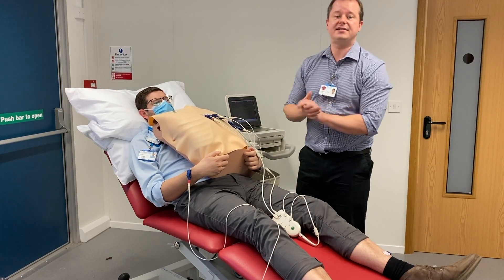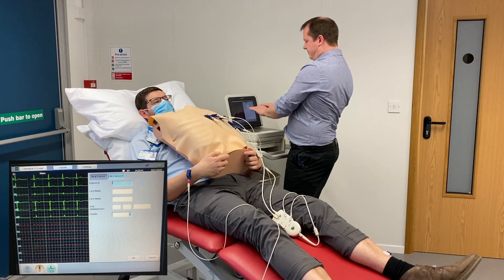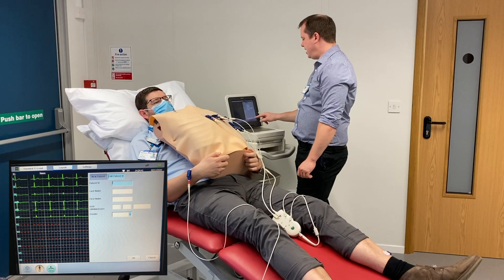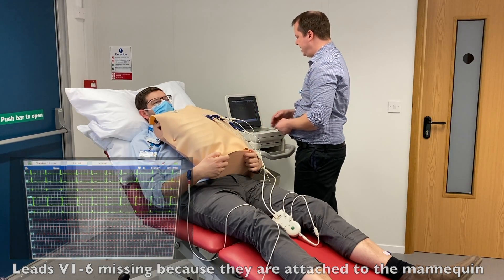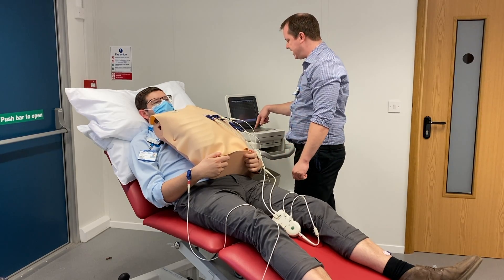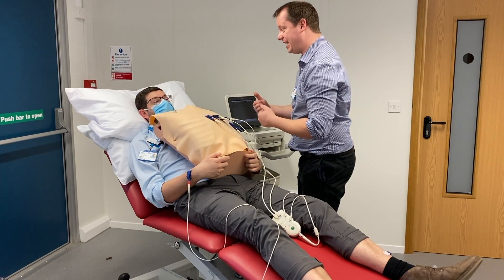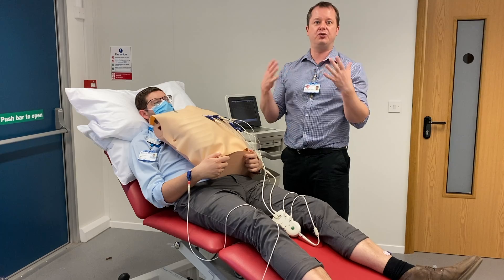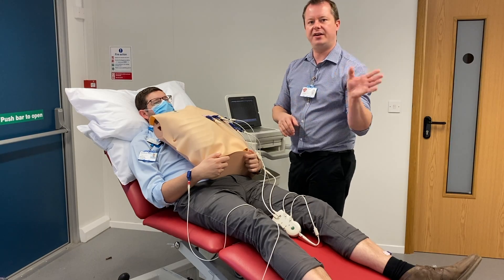Once we've done that, we want to record the ECG. We may have to enter the patient's information - their MRN which is their patient ID, their last name, first name, date of birth, and gender. Once we've got all that in, we need to look at our screen and make sure we've got a nice clear image with no interference. Then we can press the go button - the green button that says ECG - but before we press it we should tell the patient to stay nice and still and relaxed, as some patients will start talking during the silence.